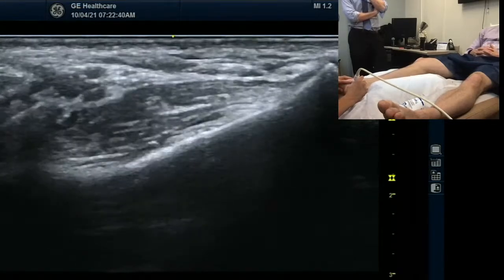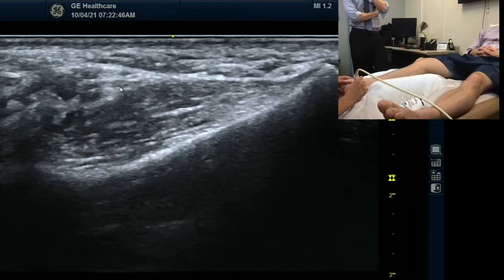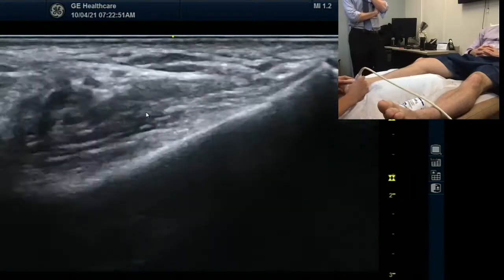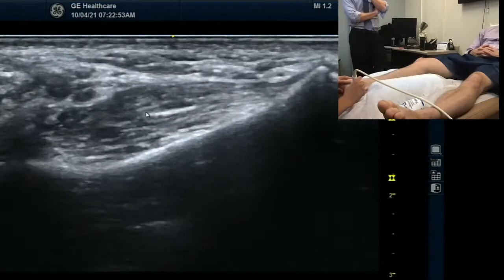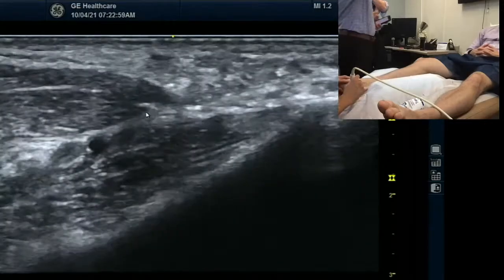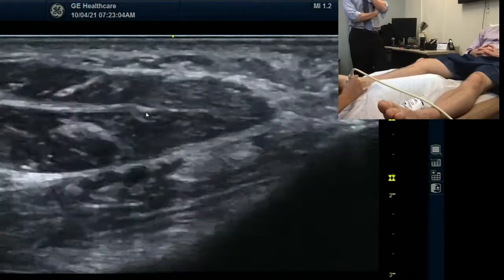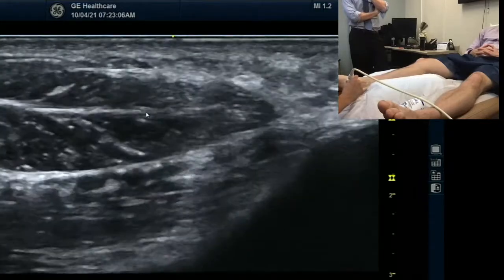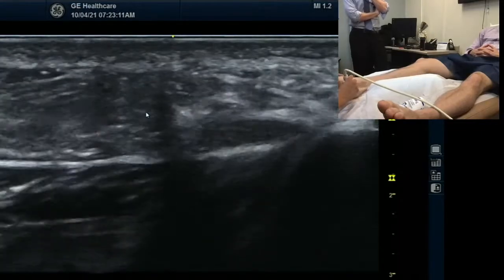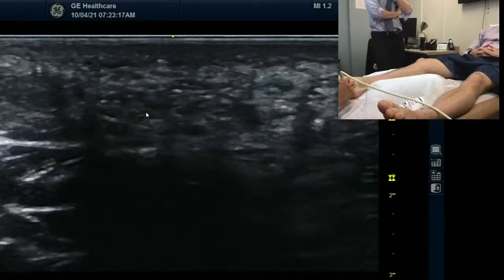But here, which one is the nerve? I cannot really see. I still think it's to the right, but I thought I had some divisions coming across. So that's why I'm doing some toggling on it. Are we starting to get — is that abductor hallucis coming into view in cross-section? So that's what I was going to follow here. The left side is the abductor hallucis. So the top one is abductor hallucis. Below that might be flexor digitorum brevis, which means the nerve should be right in that fascial plane between the two.